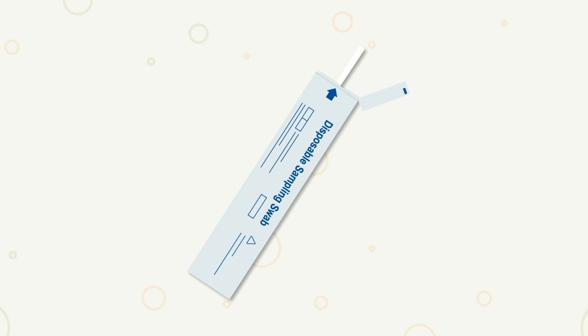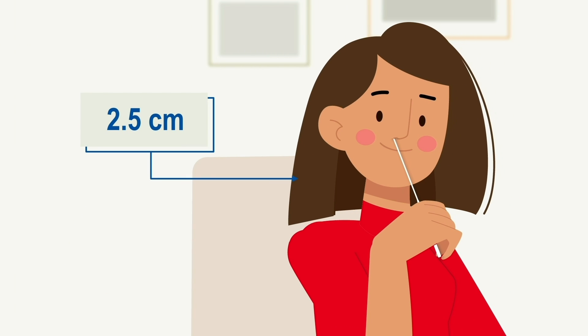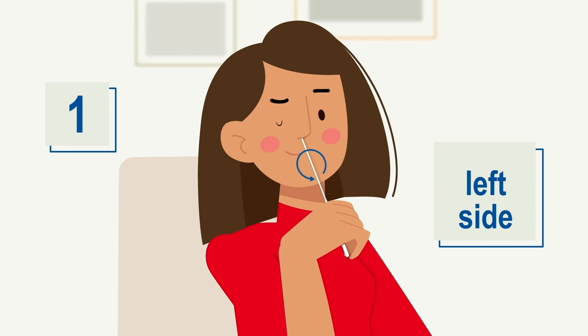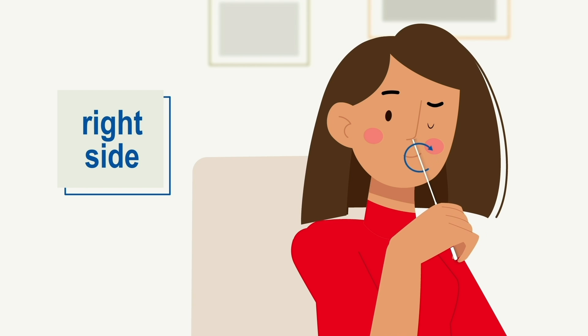Take the swab and be careful not to touch the soft part. Introduce it carefully into one of your nostrils, no less than 2.5 centimeters from the edge of your nostril. Roll the swab to be sure that mucus and cells are collected.